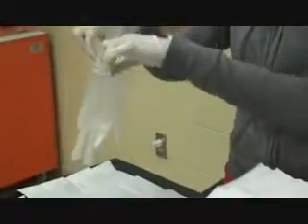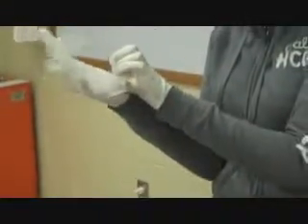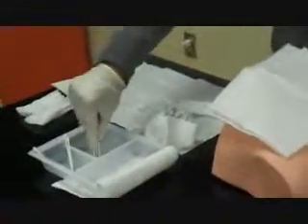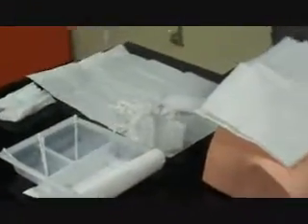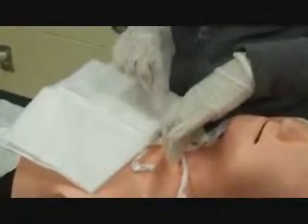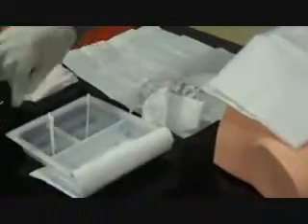That's one glove. And that's the next glove. Now I have my sterile gloves on. And then we would take one of the Q-tips with hydrogen peroxide and wipe around the stoma area in one specific direction and discard that. And then follow it up with sterile water and discard that. And you could do this about 2 times.